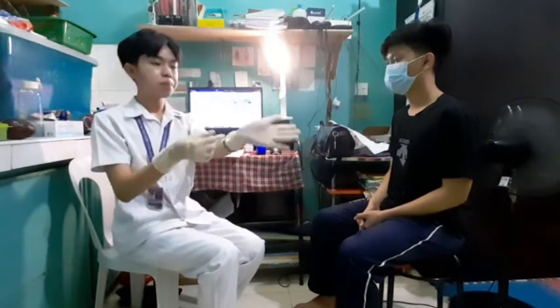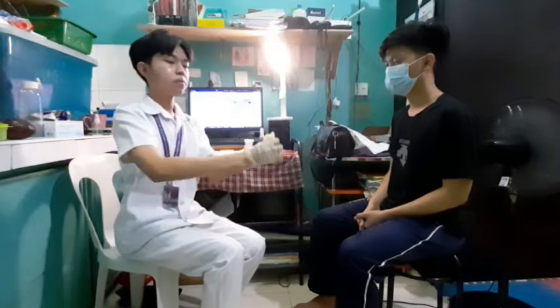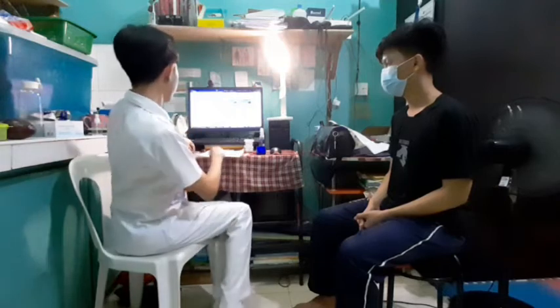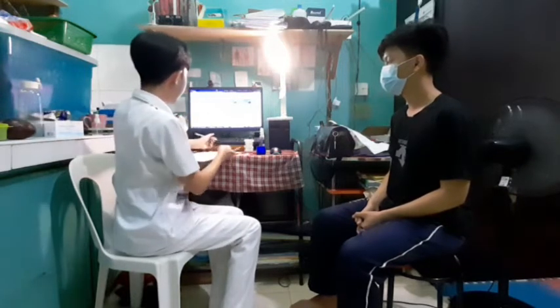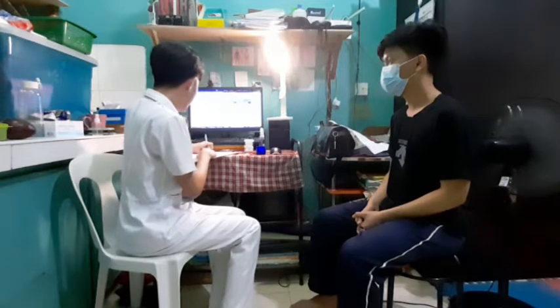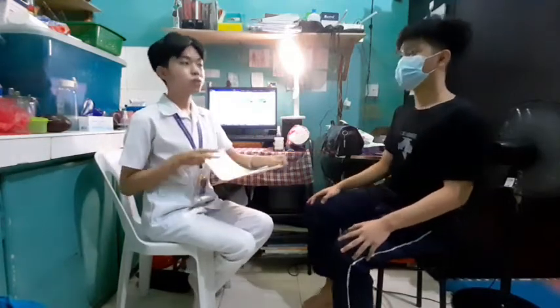I will now remove and discard my gloves. Let's move on with the documentation. I'll tell the patient their findings: your temperature is in the normal range, so we don't need to do the procedure again because it is within the normal range. Do you have any questions? I will now document the findings. We are done with the taking of temperature. Now let's go down to the axillary method.